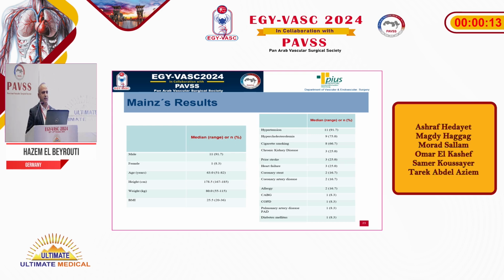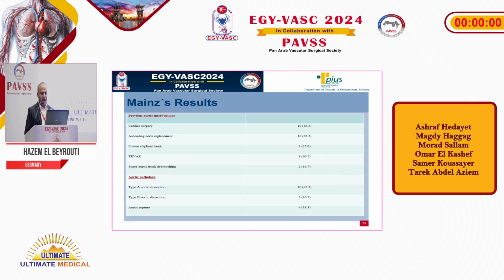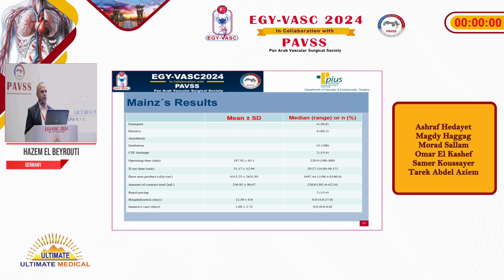So these are my results. This kind of occlusion was performed in 12 patients, but with 13 operations. Why? I will show later. As you can see, 90% of patients were male and multimorbid, and 80% of these patients had a history of type A aortic dissection with ascending aorta replacement. The average operation time was 220 minutes.